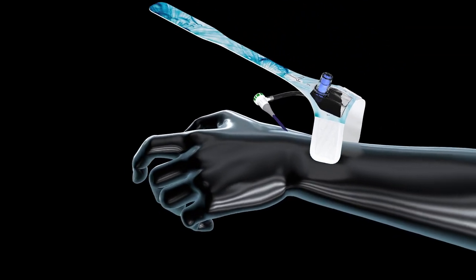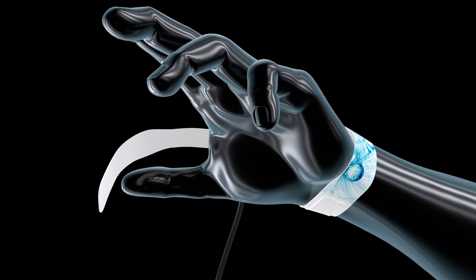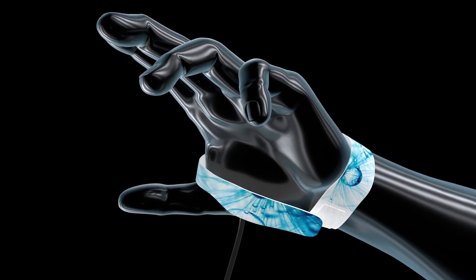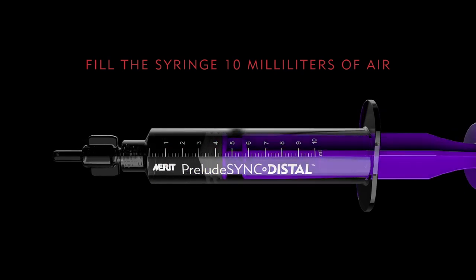Fasten the number 1 and 2 bands tightly around the wrist. Then wrap band number 3 snug around the saddle of the thumb. When the band is properly placed and secured, fill the included syringe with 10 milliliters of air.